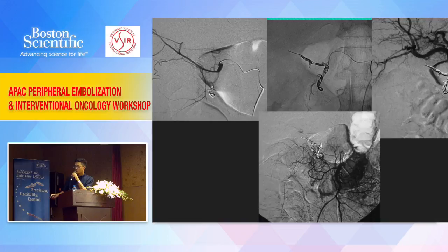And we also do the angiography for the SMA to confirm that there's no collateral circulation into the lesion.